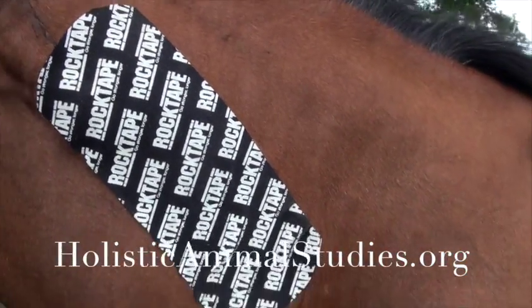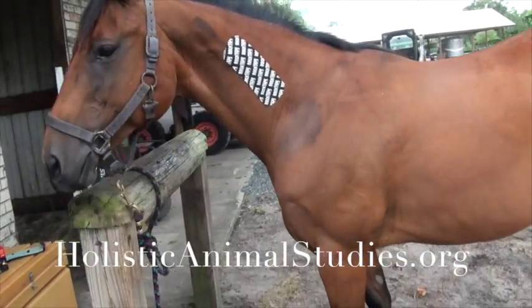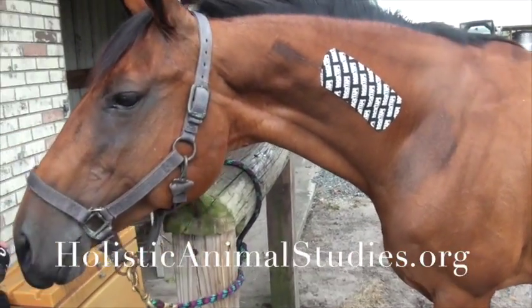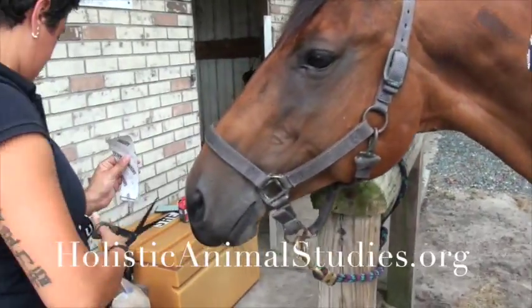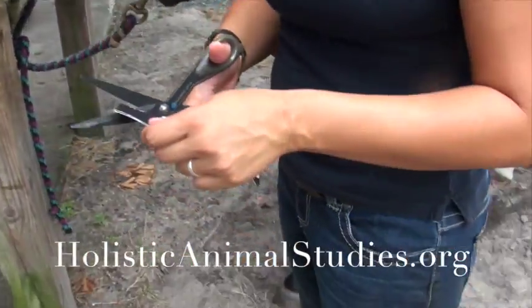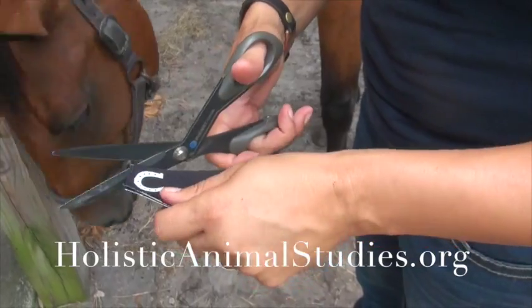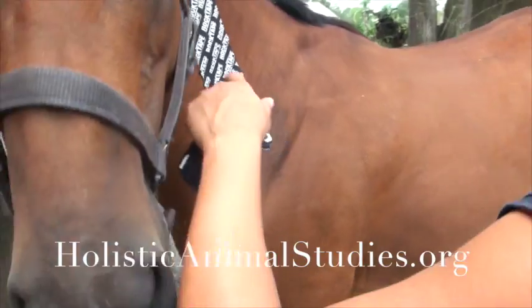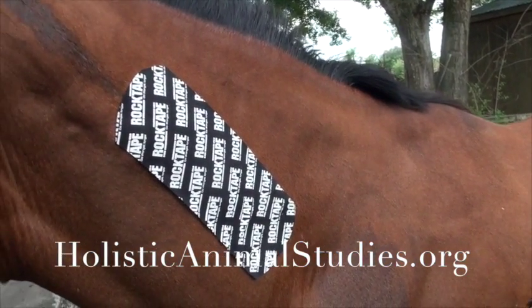Next, I'm going to cut a couple pieces of the 2-inch tape to use as anchors to help hold that down. It's also going to help with decreasing pain as well. So we're getting those pieces cut, and I'm going to round the edges on those as well — just to make them look a little bit prettier and make sure they don't stick on anything. We're going to put those at the top and bottom of the Big Daddy piece to anchor it down.